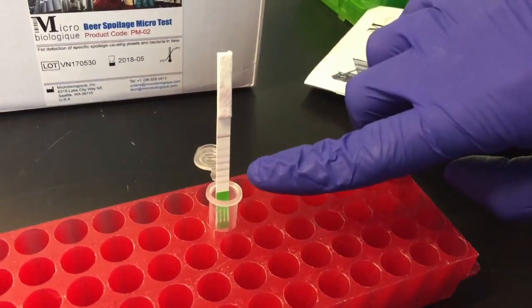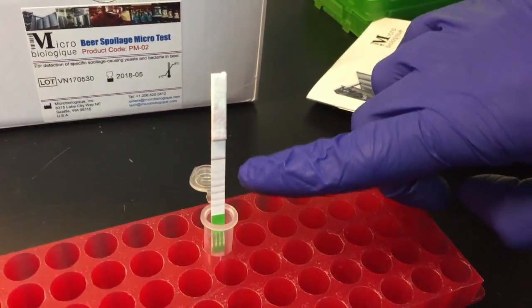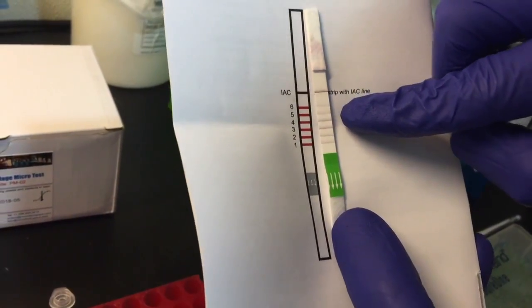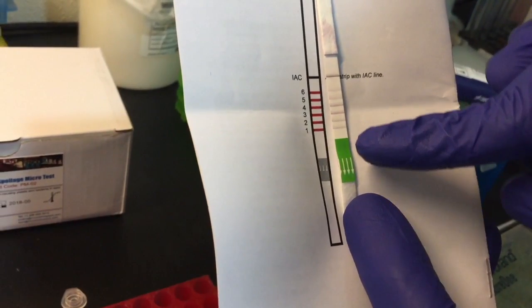Following the run, you will see that a number of bands will appear depending on the spoilage organisms present in your sample. You can position the strip against the internal amplification control line, which allows you to read which organisms correspond to the visible lines.